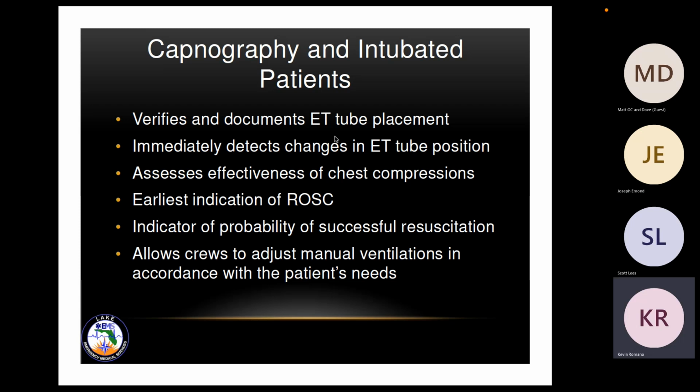And anytime you have a patient with an ET tube in place, whether it be 911 or interfacility transport, if you're going to move a patient, you want to get lung sounds prior to moving them and make sure you note the number at the teeth or the lips for the tube. When you move them, recheck lung sounds. Check your cuff again, make sure it didn't deflate somehow, because that can change your end tidal as well. We'll also start giving you more vent alarms. That's a whole different class in itself, how to make do with the vent alarms and how to treat them.